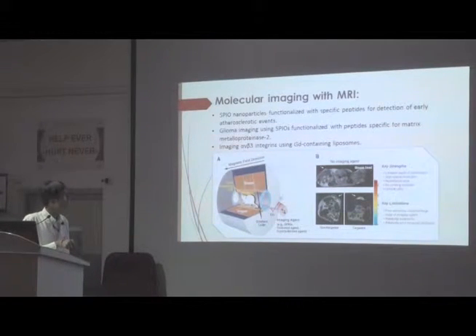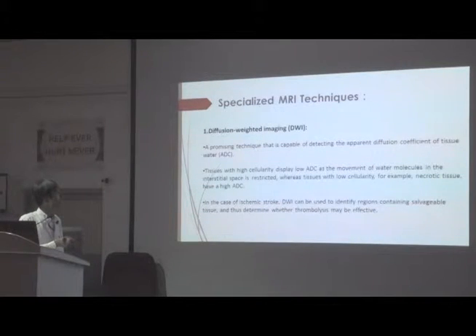This is the image which is taken by the MRI, molecular imaging, and here we can see the tumor when no contrast agent is added. If you add the iron oxide nanoparticles, contrast will be a little bit enhanced. If you use targeted iron oxide nanoparticles targeting a specific molecule, you can increase the contrast and get better evaluation.